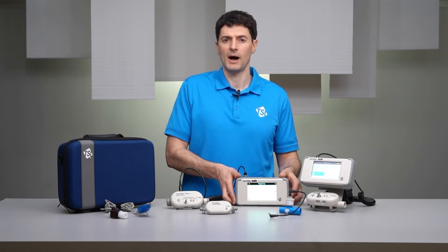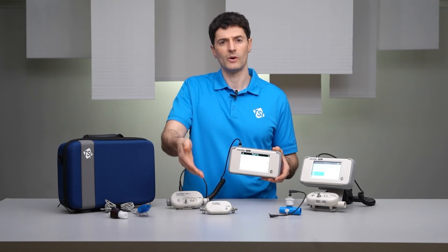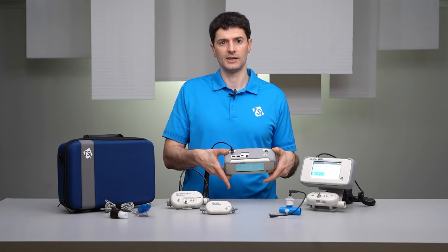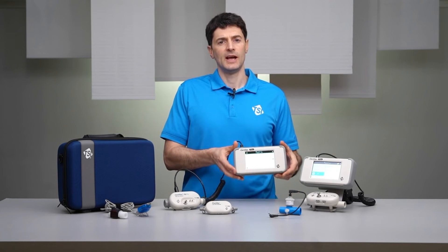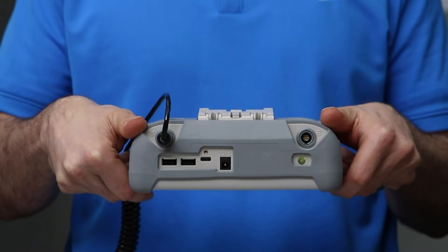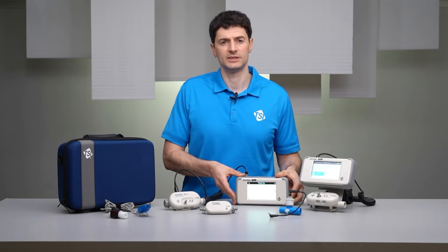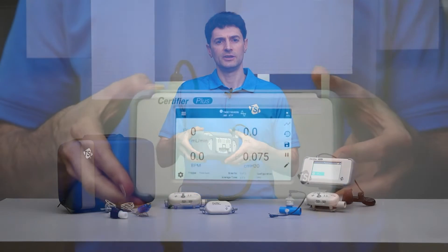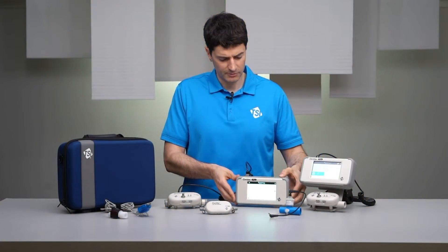The Certifier Plus Model 4089 interface module works with both the high flow and low flow modules. Flow modules can be plugged into either connector on the interface using the coiled cable. The interface has a five-inch color touchscreen display, and the USB-A ports are used to export saved measurement data or to connect the anesthesia sensor accessory. A protective cover wraps around the 4089 to protect it and prevent damage from drops or during transportation.